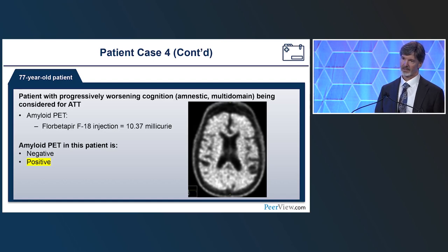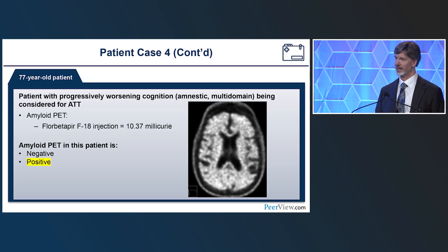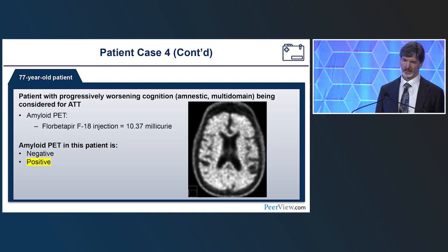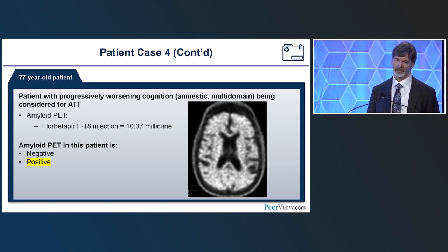You're right, it's positive. Now, why is this a little bit of a challenge? Because of the CSF dynamics, you see some areas that maybe someone could confuse with areas that are not just filling all the gray matter. Some areas that people point to that should be maybe more full. They aren't because of this person's CSF dynamics issue. So slightly confusing, but not a huge reason to call this negative. There's lots of areas that are filling out nicely right to the gray matter ribbon.